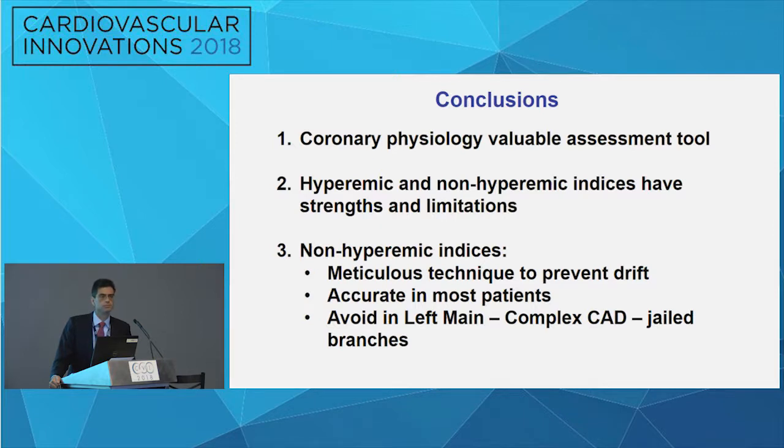Because the 70% lesion, the original study was based on normal hemoglobin. So as the hemoglobin goes down, the severity of the lesion goes up, right? I think it makes perfect sense. The problem is how do you convert? So let me put it this way: if you have anemia, and you do a physiologic assessment, and it's actually normal, I think you're okay. Because if anything, you're going to have more flow at rest. If you don't have significant pressure drop despite higher flow, you're fine. So if it's within the normal range, I think you're done.